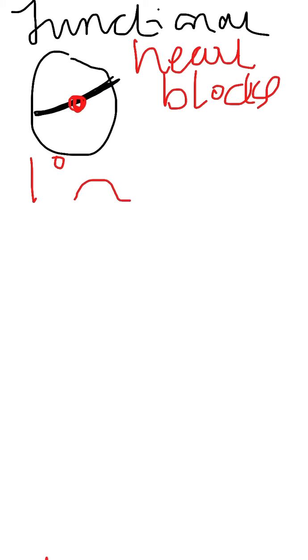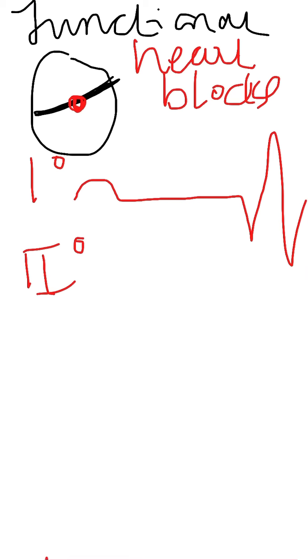the supraventricular area. But when you come to the second degree, the second degree has several types. I'm going to give you the basics first, and then give you some homework to read up on how this can vary. So what you will see in the second degree heart block is that there's more severity of the exaggeration of this segment, in that you're going to see some P waves not actually producing the QRS.